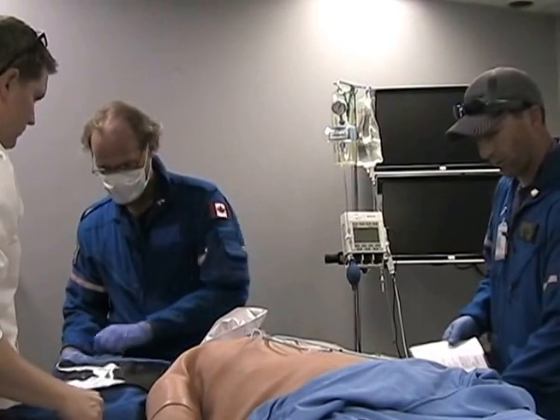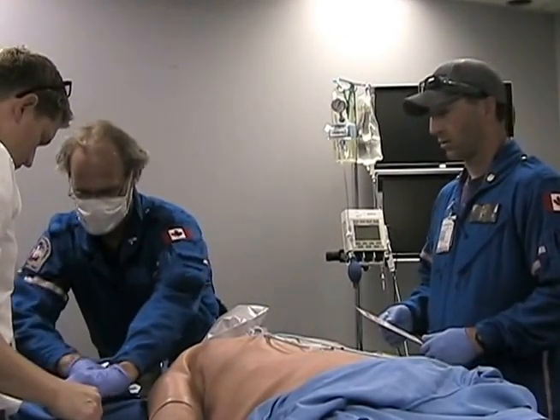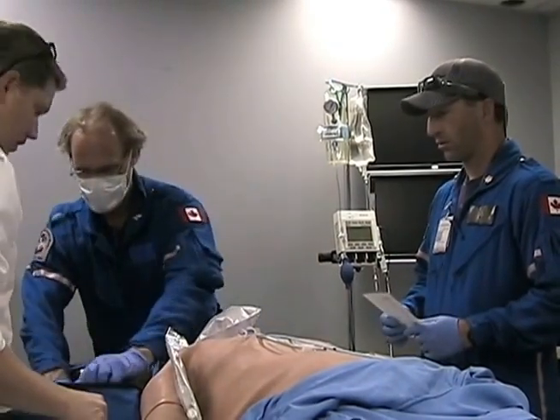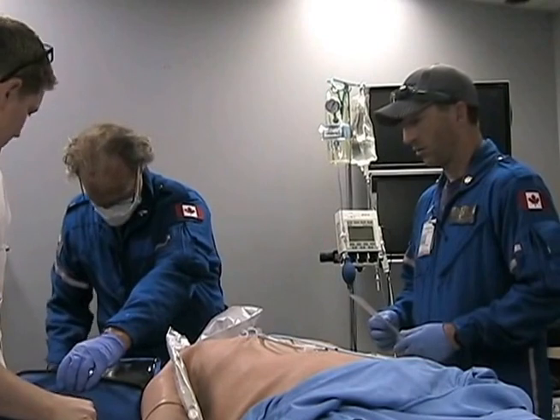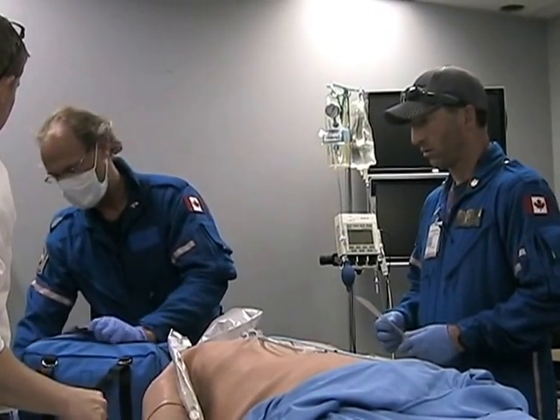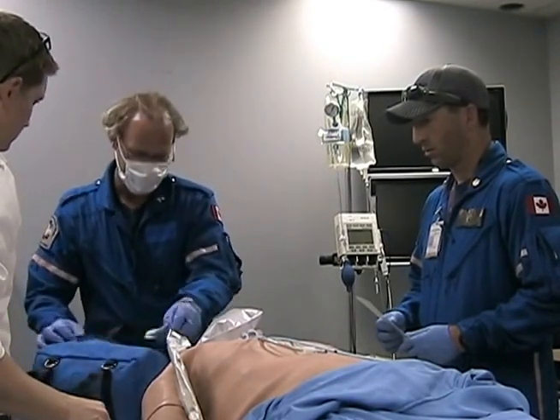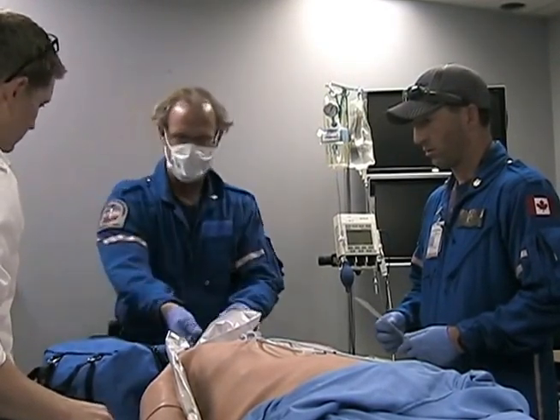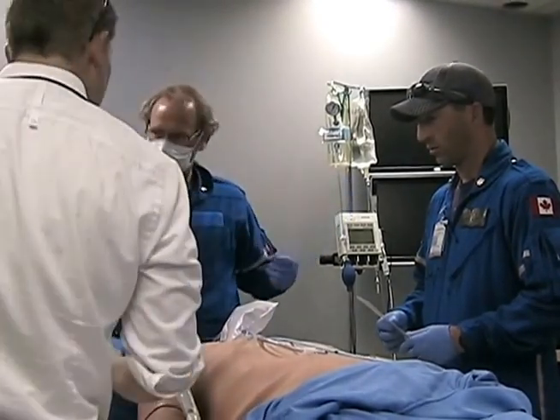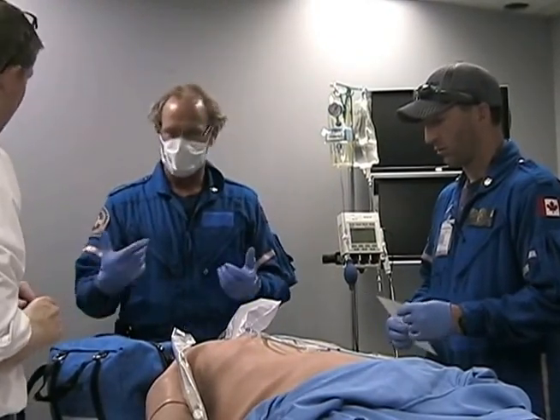Okay, so James, just while we're getting the rest of the stuff set up here, what I want you to do is you're going to be my assistant. So you're going to help me with the stylet, and you're going to be holding ELM. I'm going to have your fingers on his neck, right on the cricothyroid membrane or the thyroid cartilage. I'll move your fingers if I need them moved. And then I also want you to be calling out the oxygen saturations too. So you're going to have to turn sideways, or wherever you can best see the monitor. Okay, perfect. And then if I need the bougie, I'll have you help me with the bougie as well, and then you'll help with the cuff.